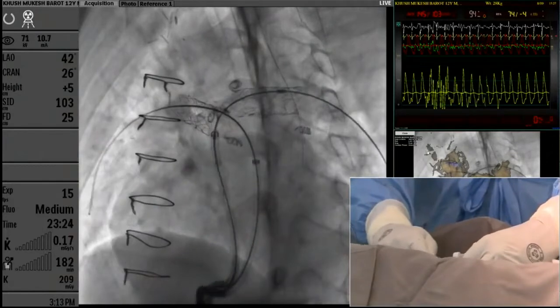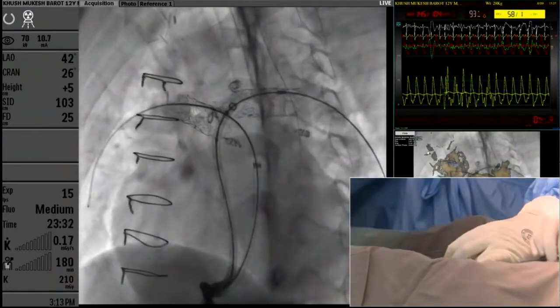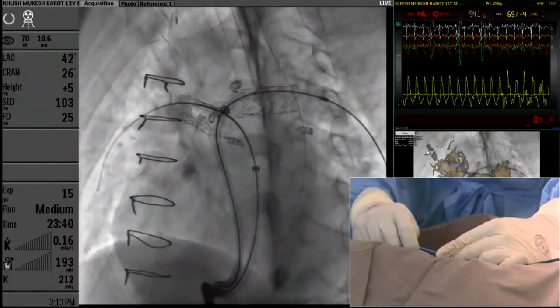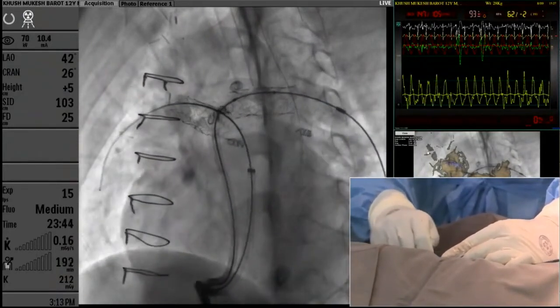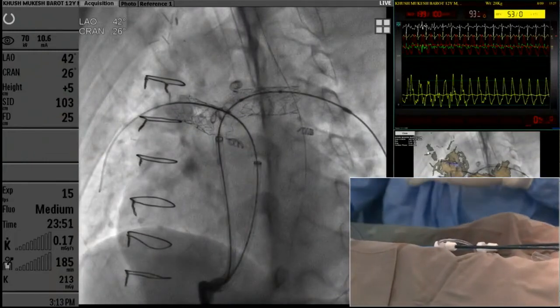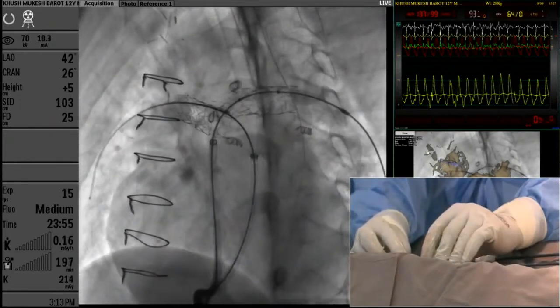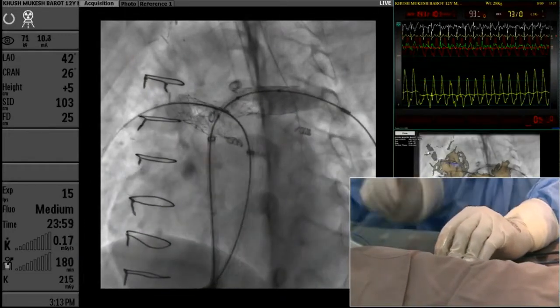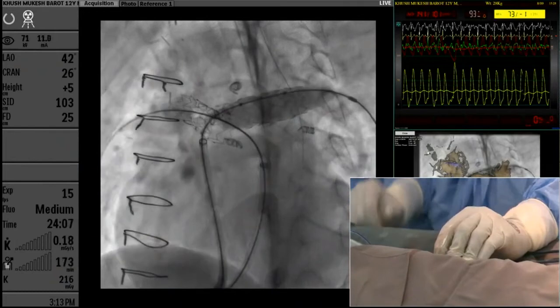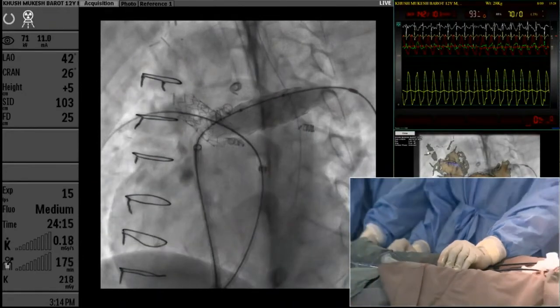Shiva, somebody said the burst pressure for Atlas is only 18. I thought it is. Yeah, this 14 millimeter is 18. Okay. So now I'm actually jerking my way in because sometimes what happens is this Atlas has got an ultra high molecular weight polyethylene, which is like a cloth. Go slowly to 18. Yeah, keep on going. It will take a long time to inflate and a long time to deflate also. I think the proximal is dilated. 18, okay, deflate.